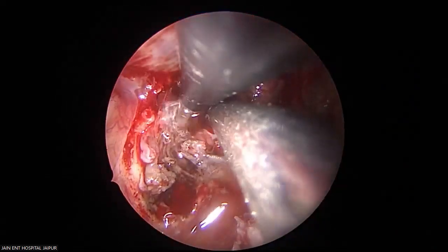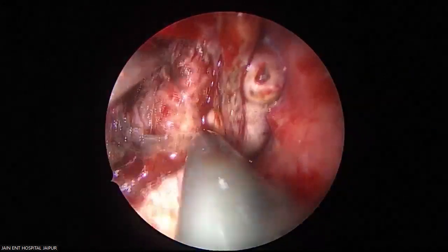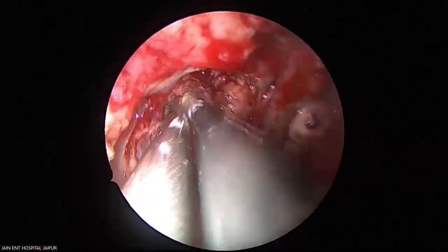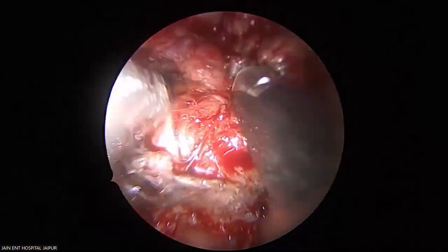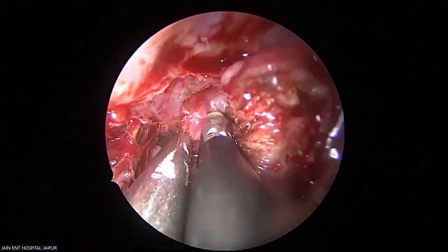See, I told you I'm looking superiorly because my angiogram told me it is quite high up. See this, the level of the floor. I am seeing so high up. If you had seen the day before demonstration, it was showing 1.5 centimeters. So I went inferiorly and I found the vessel there.